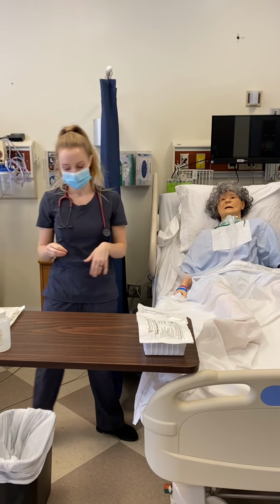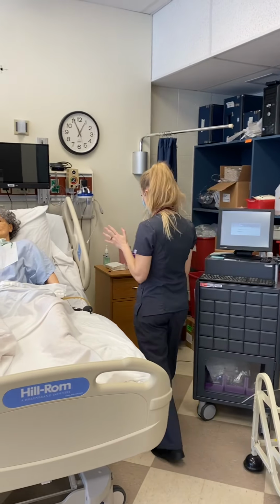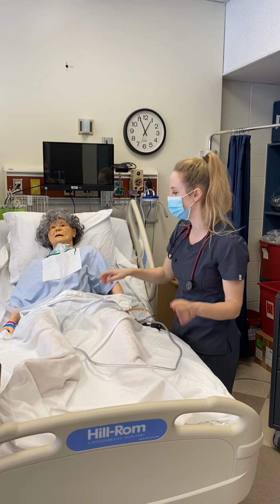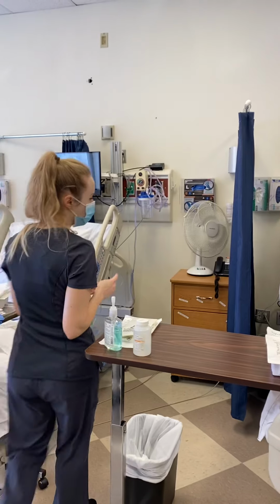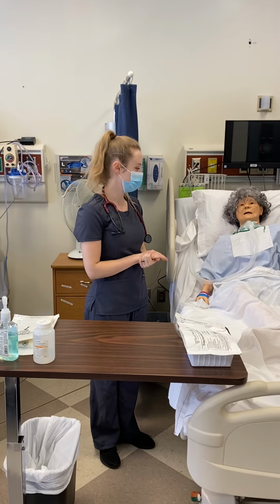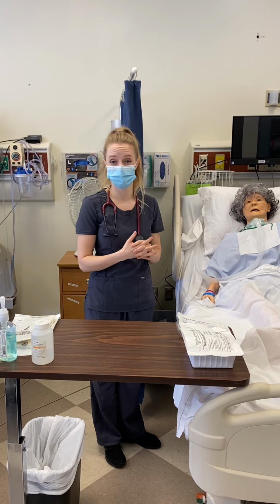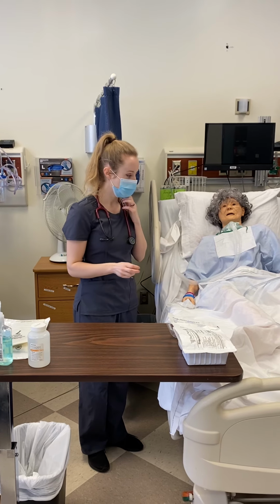Next, I want to turn my suctioning on. I will turn it on to somewhere in the range between about 80 to 100 and have that ready to go and assess my patient for why they are needing suctioning. They may be gurgling, they might have secretions, they may have a decreased oxygen saturation, adventitious breath sounds, cyanosis, a rapid rate of breathing, shallow breathing, or an increased pulse rate. So once I have established my reasoning for suctioning, I will proceed.